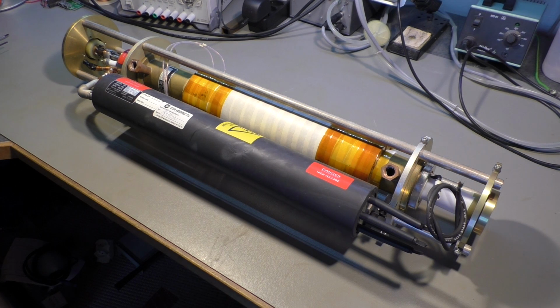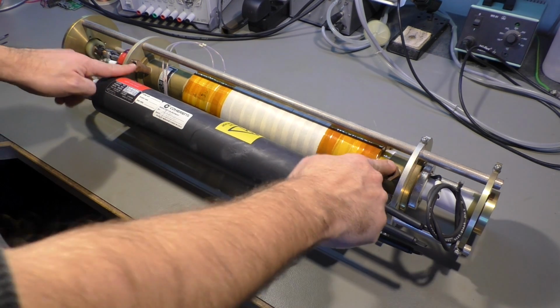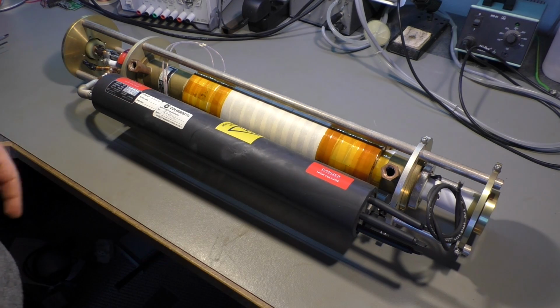Hello again. As promised in my last video, I make another video with the laser tube here. This is an argon laser tube from a medical laser. It has an output power of about 2.5 watts, and it needs about 10, maybe 20 kilowatts to produce this laser beam. So the efficiency is very bad. That's the reason why we have water cooling here.